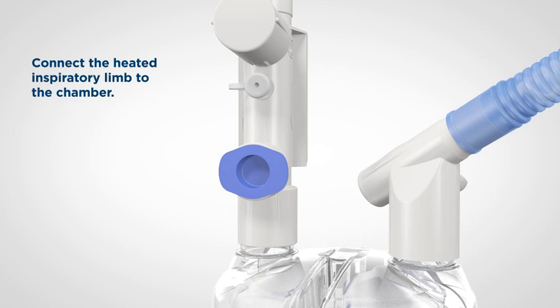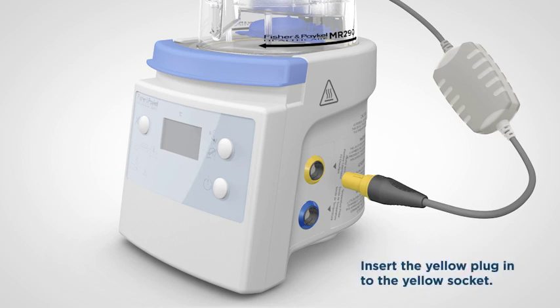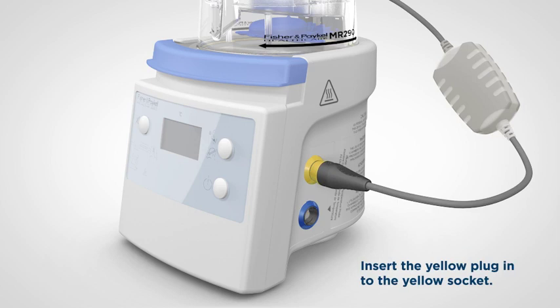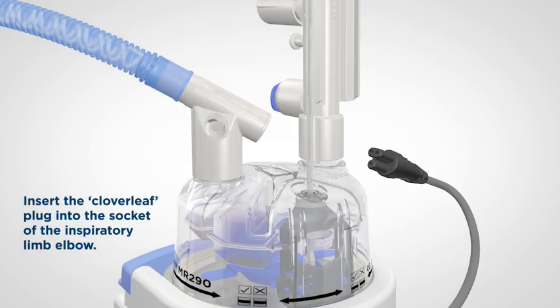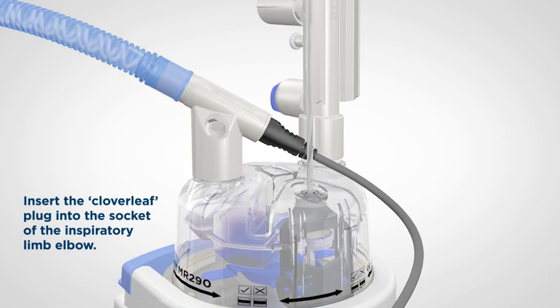Now let's connect the heater wire adapter and temperature and flow probe adapter. The heater wire adapter connects the heated inspiratory limb to the humidifier and provides energy to power the wire in the limb. The humidifier adjusts the energy delivered to the wire to maintain humidity and reduce condensate in the inspiratory limb. Connect the yellow plug to the yellow socket — the socket is both colour-coded and keyed to the plug; you may have to turn the plug until it slides in easily and clicks into place. Connect the other end of the adapter, shaped like a cloverleaf, to the white socket at the back of the elbow connector on the inspiratory limb. Be careful to line the plug and socket up to avoid damage to the breathing circuit or adapter.